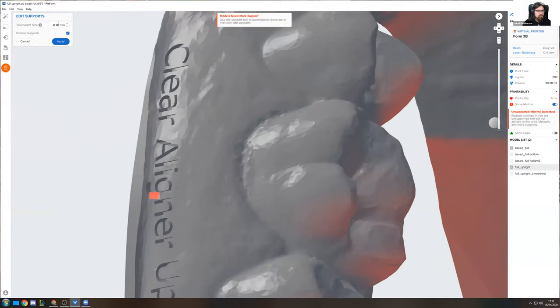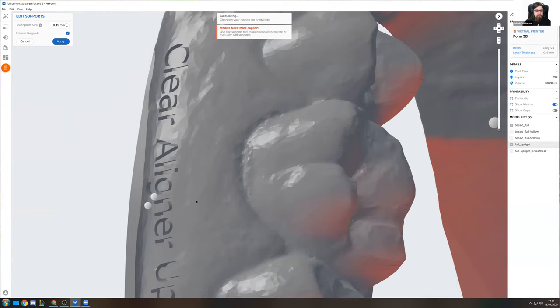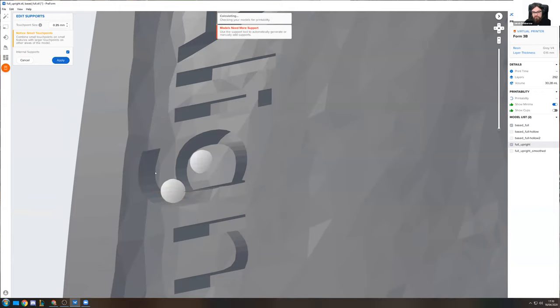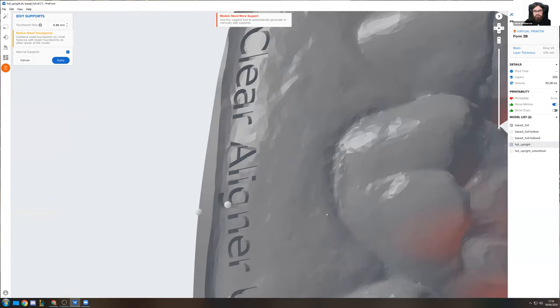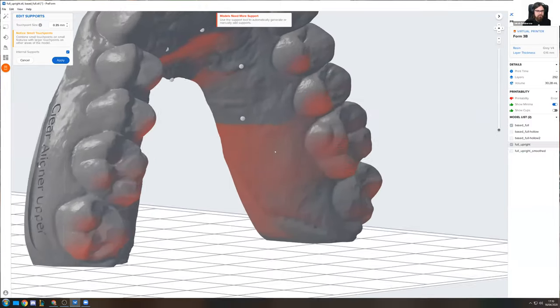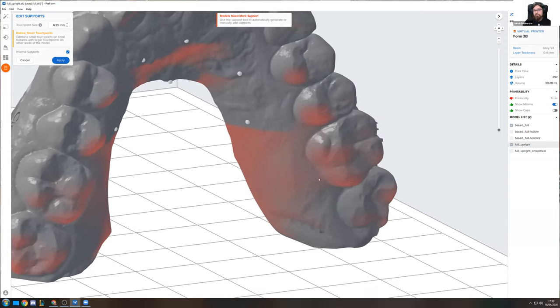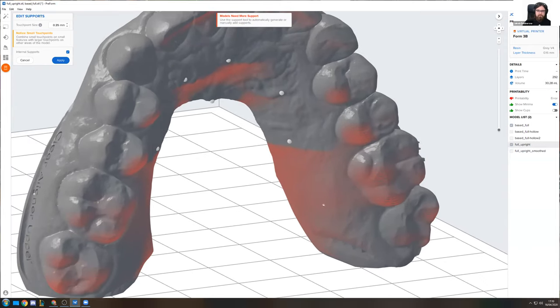I can also go in here on this detail. I'm actually going down in touch point size right up here. So that basically makes this little point much, much smaller and makes it easier for me to take this off. In this case, it might be easier to not have this island be created due to this writing right there, to either have the writing be erased, basically, instead of coming out of the model, so not embossed. That's one of the solutions that I can do there, or I can just leave the model be printing flat on the build platform itself.